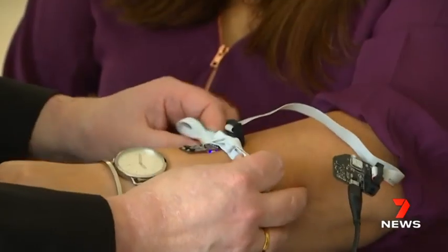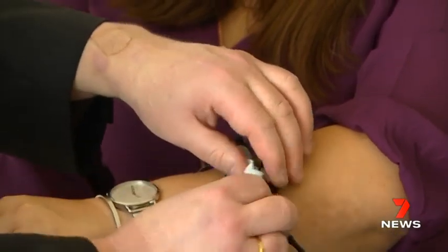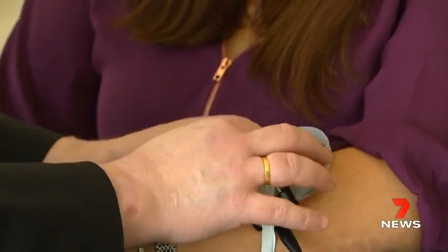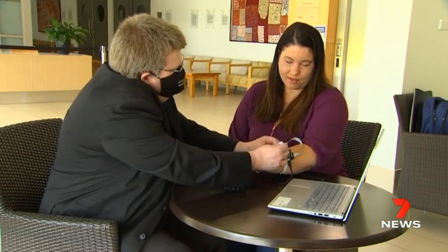Well, if you think about an MRI machine, it measures the blood flow moving through a person's body, and it uses that blood flow to create a picture of where different parts of the body are. What we're doing is doing that with light instead of high-powered magnets like an MRI. Using the combination of the new sensor design that we have, as well as the improvements in electronics, we're now able to do it with low-powered near-infrared light, and it's going to be really, really helpful for people who need this kind of therapy device.